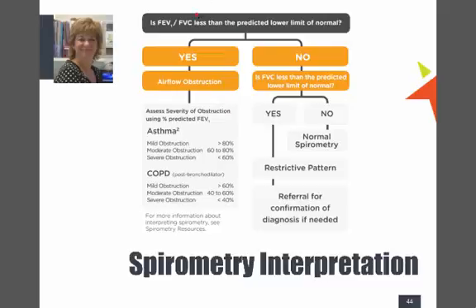If I don't have obstruction, if this ratio is normal, that means the air is getting out at the same as a normal level, let's just say. So that means that person can get their air out like any other normal person. That means they don't have obstruction. They don't have COPD. They may have asthma, but they're obviously not having a flare-up or an exacerbation.